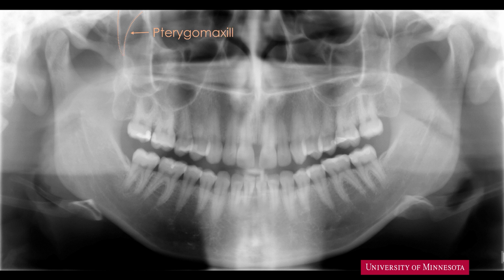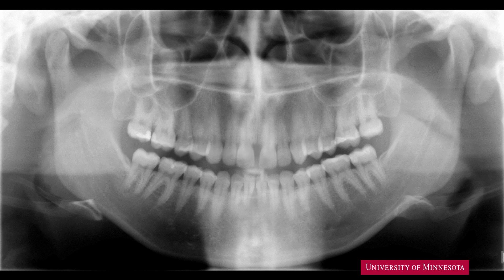Superior to the coronoid process, we have an inverted teardrop-shaped radiolucency called the pterygomaxillary fissure. A number of neurovascular structures are present in this fissure. On the anterior aspect of the ramus, the radiopaque band is the external oblique ridge. Now that we know the sigmoid notch, the coronoid process, and condylar head, we can see a radiopaque band on the superior aspect of these structures — this is the zygomatic arch.